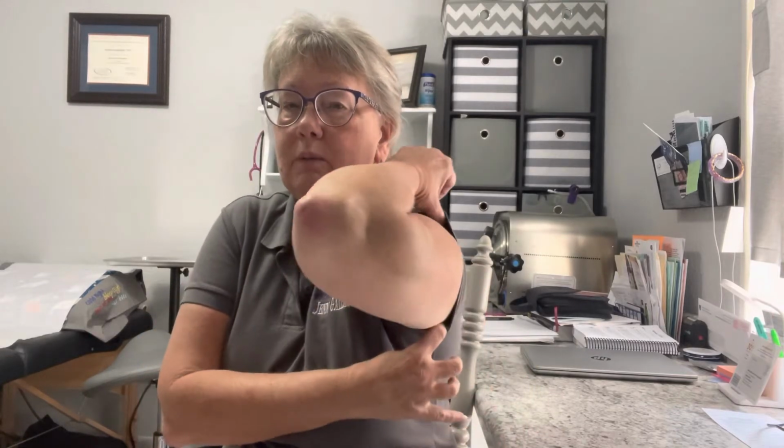So that's how to give yourself an injection. If you have someone to give you the injection and you don't have to give it to yourself like I did, you could use your deltoid. Many people, when you go to clinics, the nurses will inject your deltoid as an intramuscular or IM injection, and that's appropriate as well. But it's hard to do this yourself because if you're holding a syringe, whoops, I just splattered on my camera. So if you're holding that here, it's difficult to get the right angle and it can be more painful. So it's not something I recommend you do for yourself.